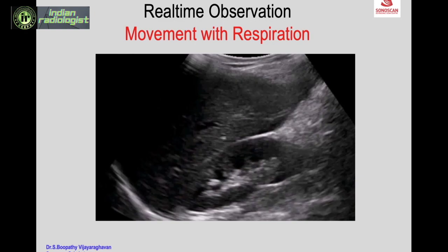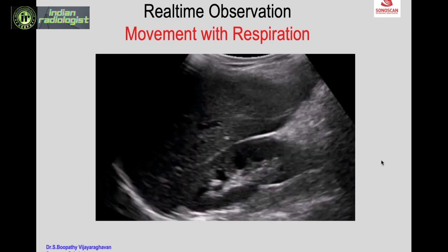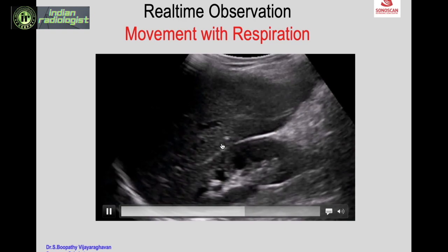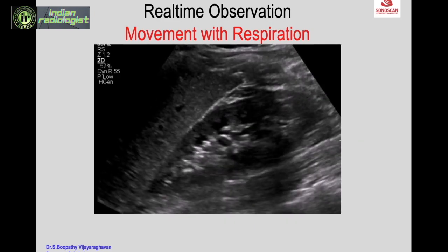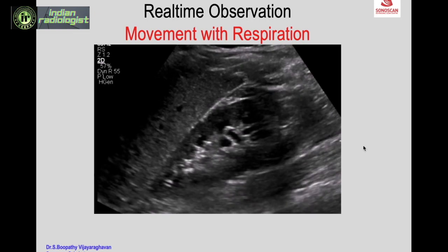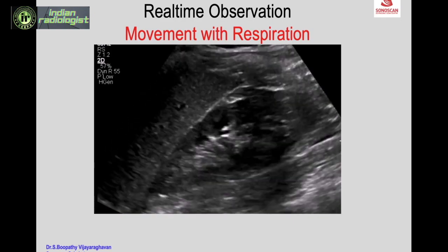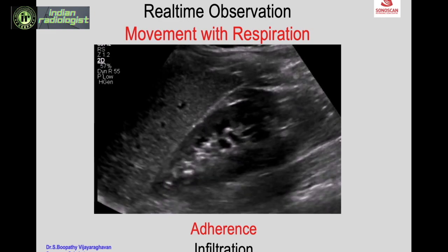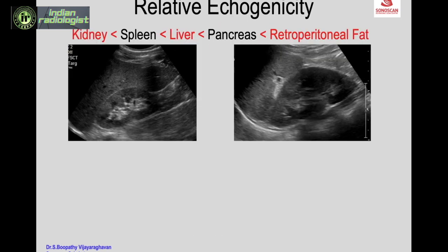In real-time observation during technique and protocol, we must observe the movement of the kidney with respiration. Even though the kidney is a retroperitoneal structure, we see it move with respiration. The liver also moves with respiration, but you will often appreciate a differential sliding movement of the liver over the kidney, brought out with a forced movement — you can see the liver slides over the right kidney. This movement will be restricted when there is inflammation and adherence of the kidney to surrounding structures by infection or infiltration.